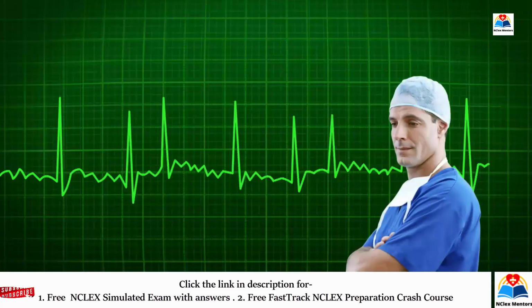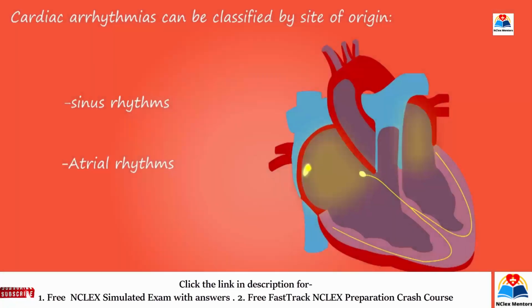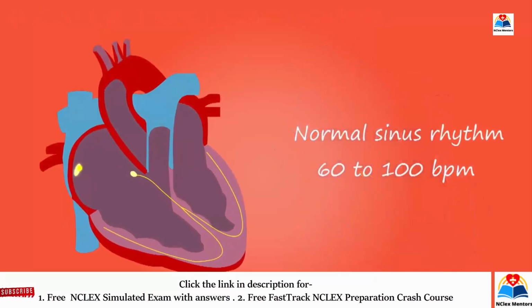Along with the theory, I will be explaining things with many practical explanations, quizzes, and case studies in an NCLEX format so that you can overview the real exam-based scenario when going through these questions. I will try to make it as simple as possible so that you can memorize things quickly for your exam preparation.